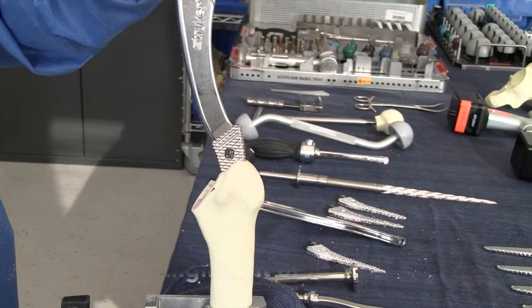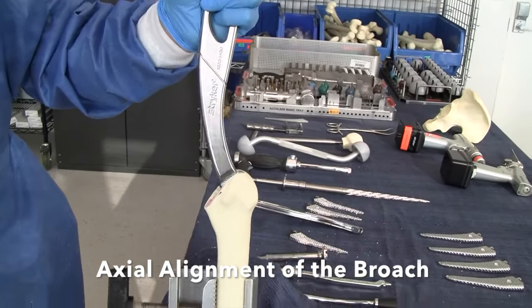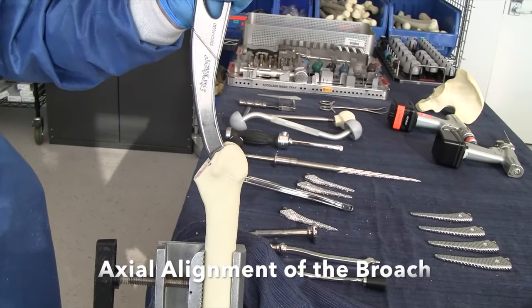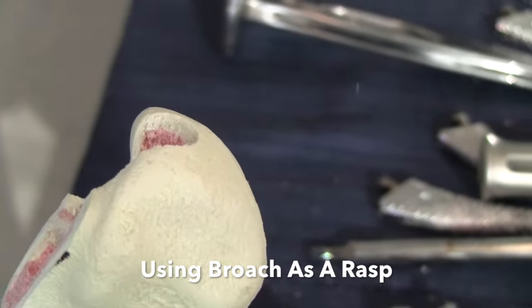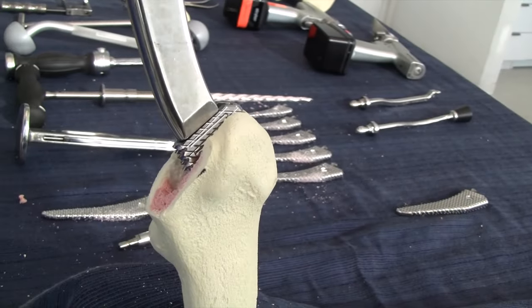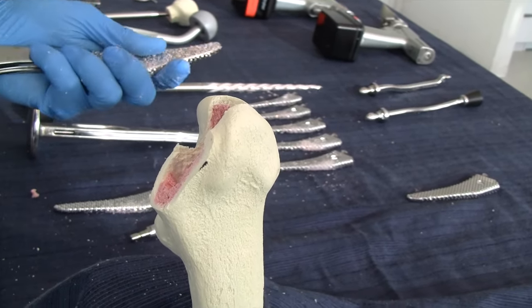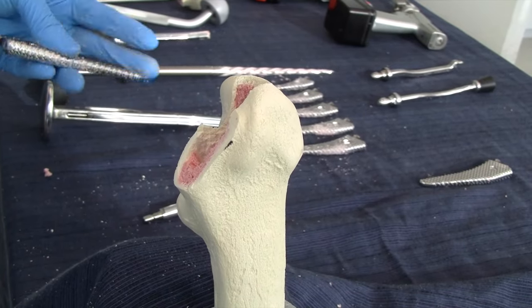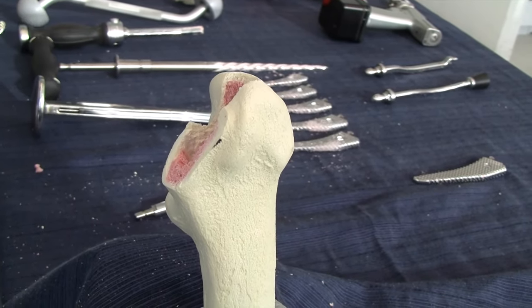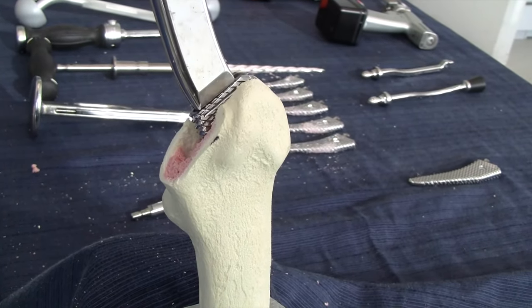Start with the size zero broach and proceed until proper press fit is achieved. The broaches should always be advancing; there are two circumferential grooves at the top that help you confirm this. On this saw bone, we could not advance the number six broach and we still had not achieved proper stability. In cases like this, back down one or two sizes — that will create a pathway for the proper size broach.